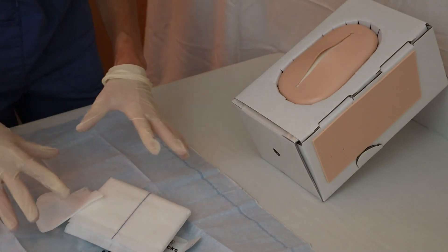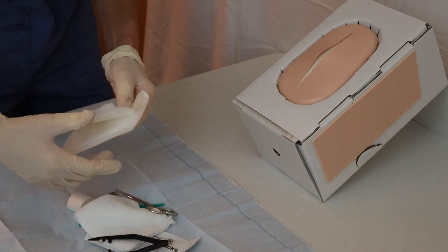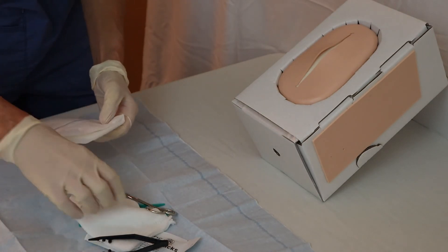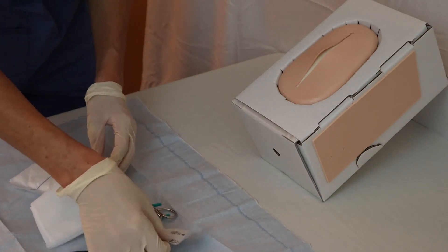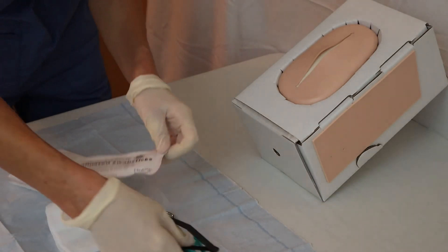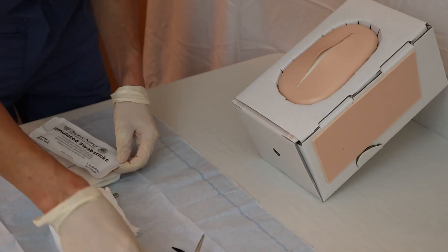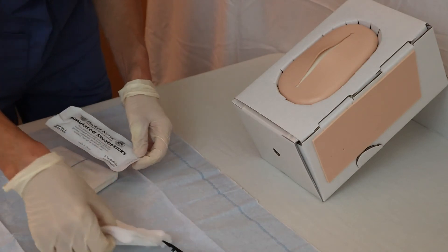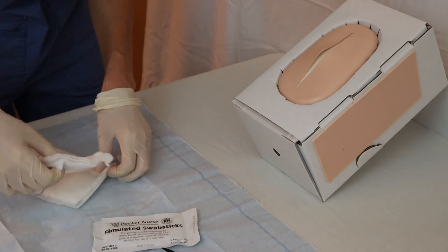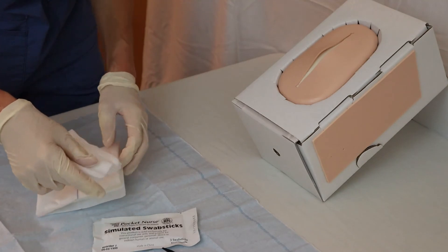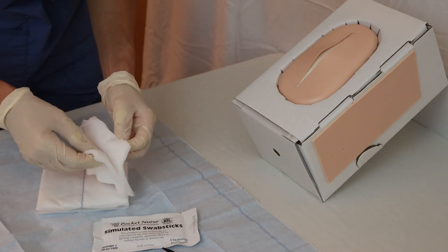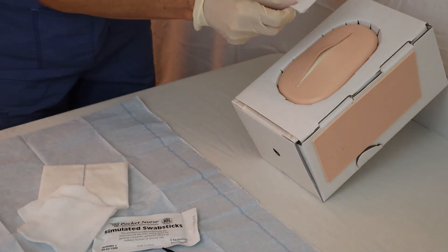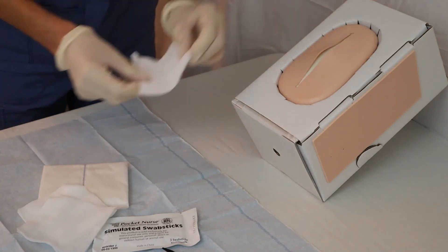Now everything here is sterile, my sterile gloves. I can touch everything here but I'm going to be careful not to go within that one inch margin. There's a couple of things that I'm not going to need which are these forceps. I'm probably not going to use these scissors either. I don't really need tape because I already got my paper tape ready. Really all I'm going to need are my cleaning swab sticks, my gauze and my ABD pad which is what was previously on the dressing. This is fairly simple going forward now because I'm just going to use the gauze and place it over the wound. Actually, first I need to clean it.